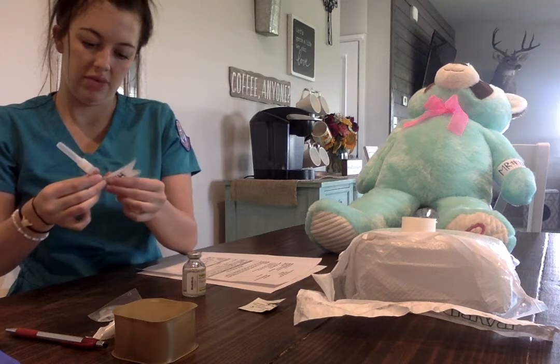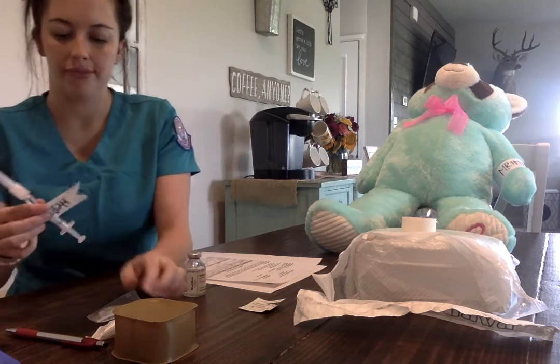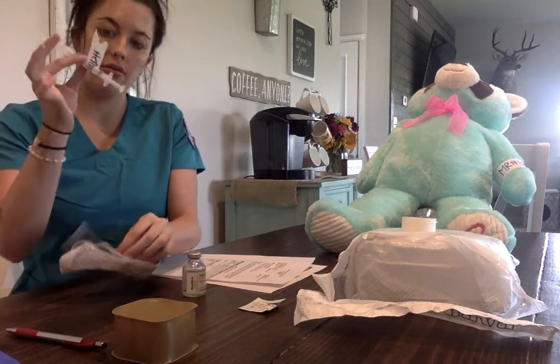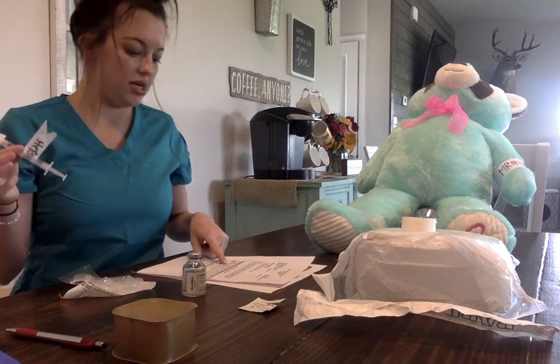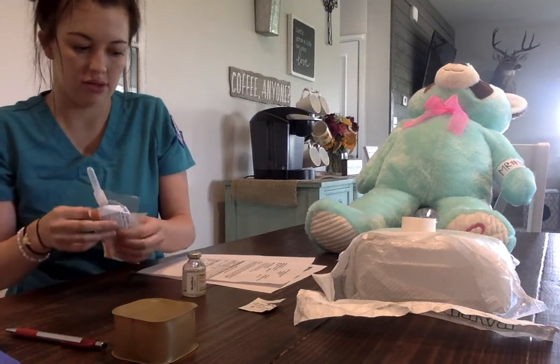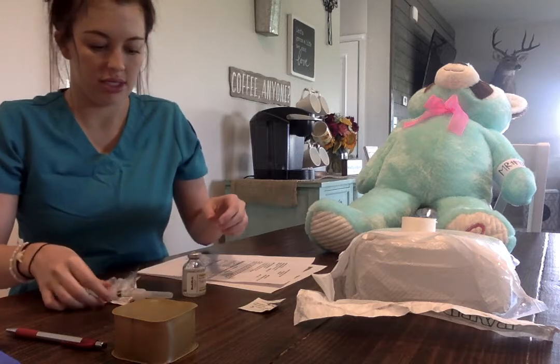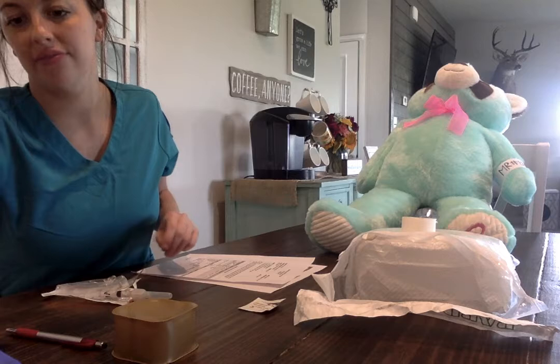I'm also going to keep it out of the way so I can see. But there we go. So heparin, 1 ml. Heparin, 5,000 units on the MAR. Okay, so that's ready to go.